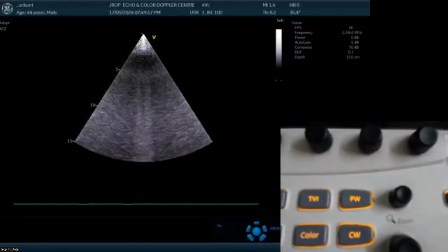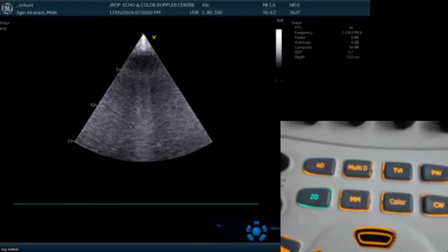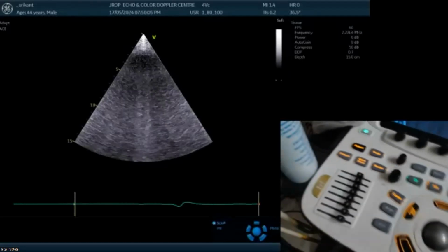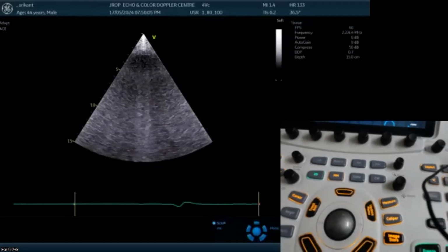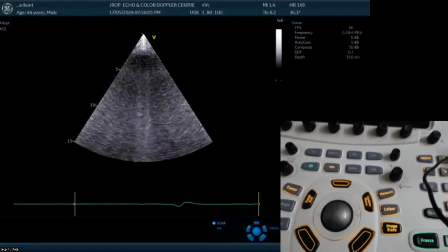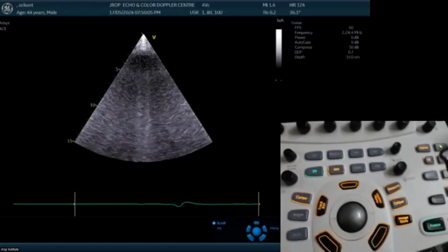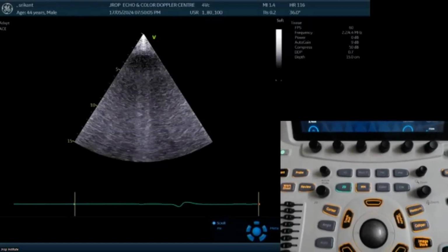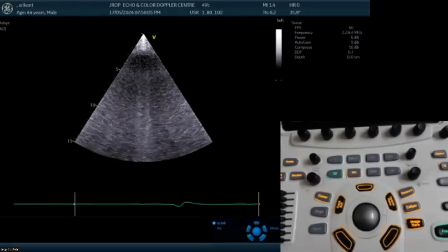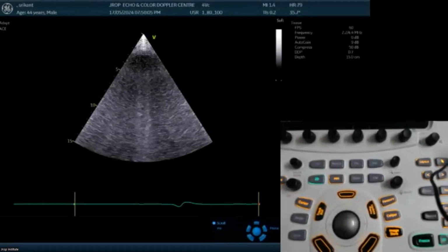And those people who have got a machine, believe my word, sit down with the machine and play with the machine. The best part is, suppose you press something wrong, what is going to happen? Switch off that machine, switch it on again. It will go to the factory setting automatically. But you will have to play with the system, play with the machines. And those who are really looking forward to learn echocardiography, take my words, all of you should spend about 1 hour to 2 hours every day practicing one subject. And at this moment, just on 2D imaging qualities.